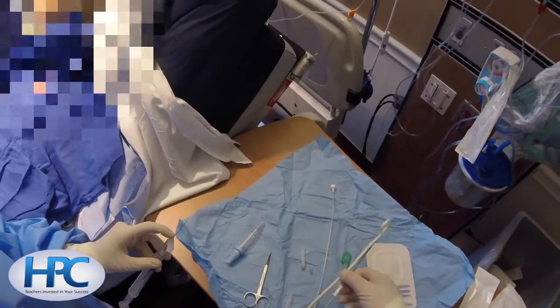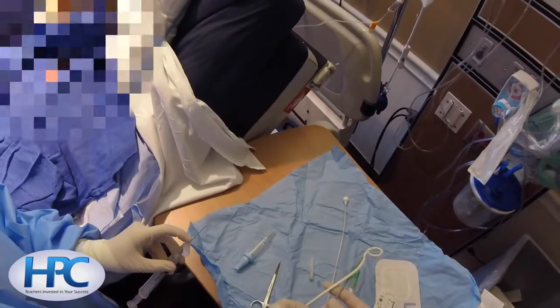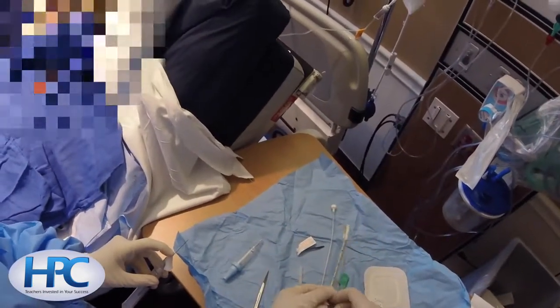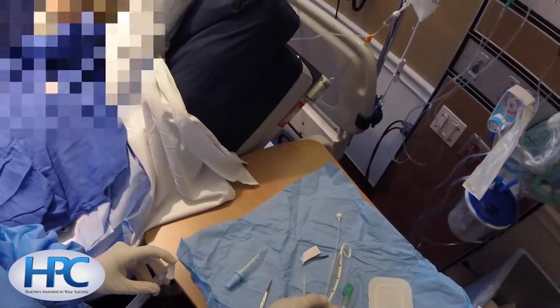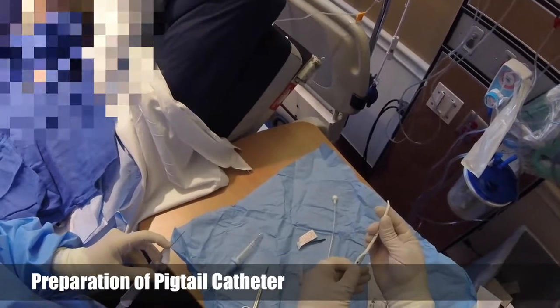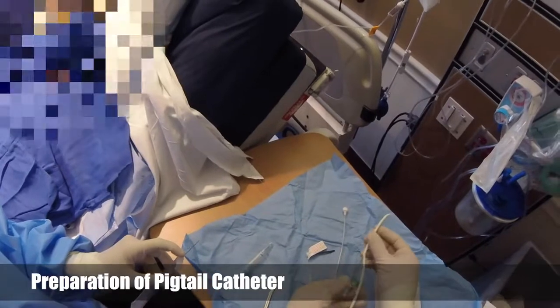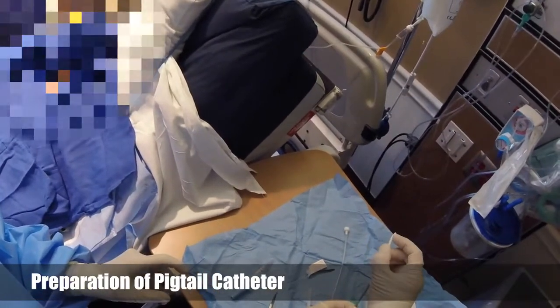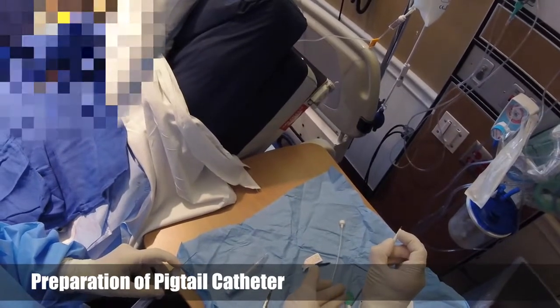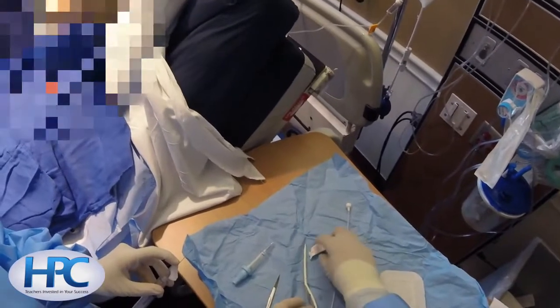Now we're going to activate the pigtail catheter. The first thing we do is pull off the black protection, and then we will advance the gray dilator to gradually lengthen the catheter. We're going to use our finger along the side of the catheter to straighten it out as we push the needle through the catheter. So now it's a fully straightened catheter.